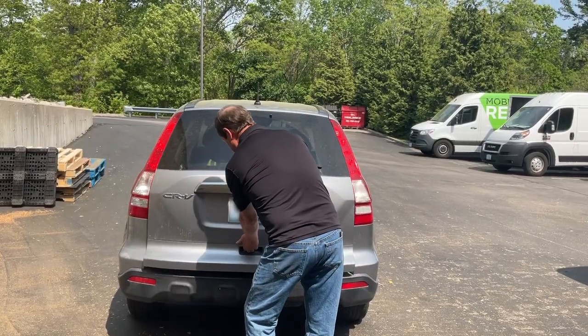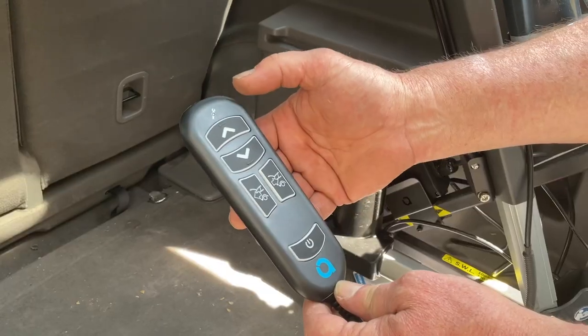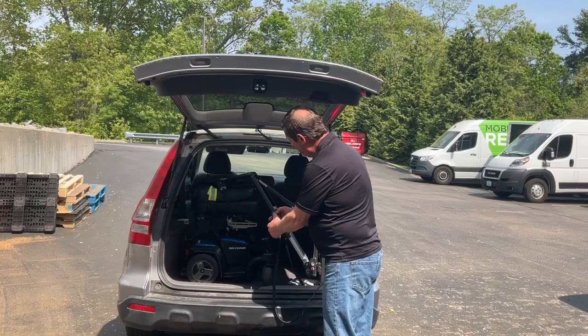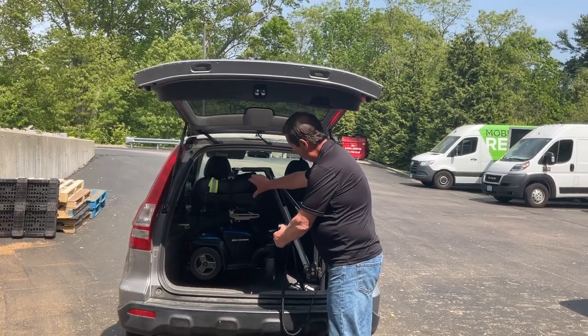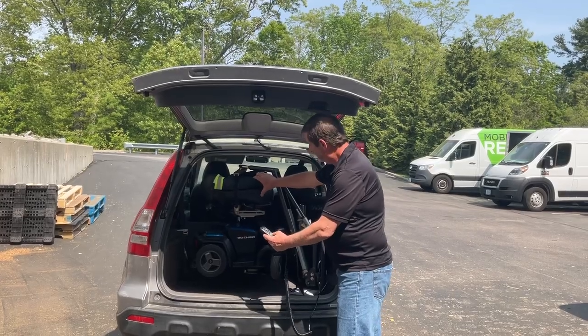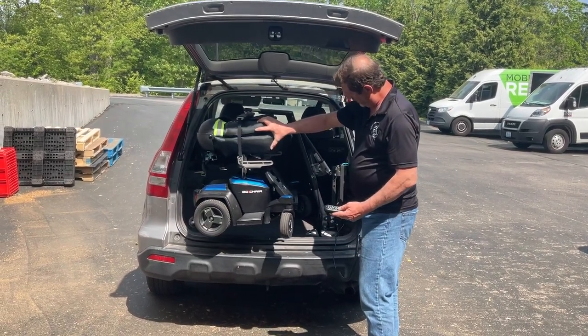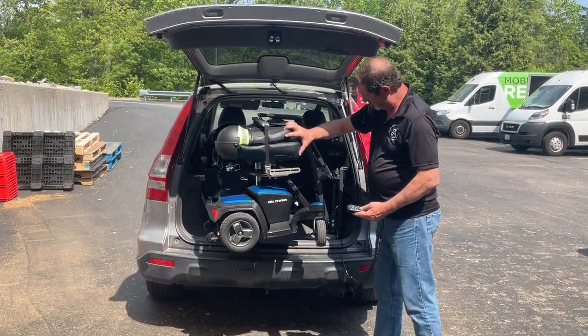Now we're going to demonstrate how to use the Smart Lifter. First, as you see it's attached, we will lift it up off of the car and swing it away from the vehicle with some guidance to keep it aligned and from hitting any of the sides of the inner car.